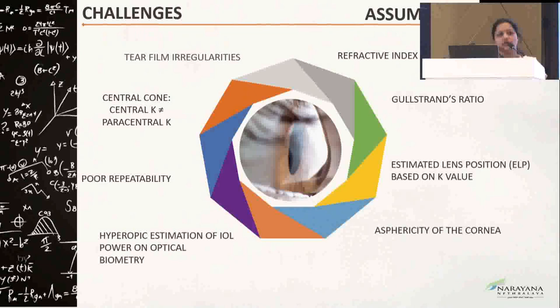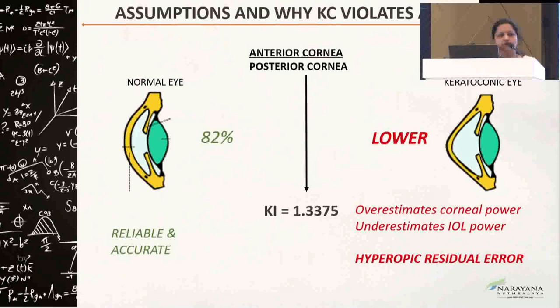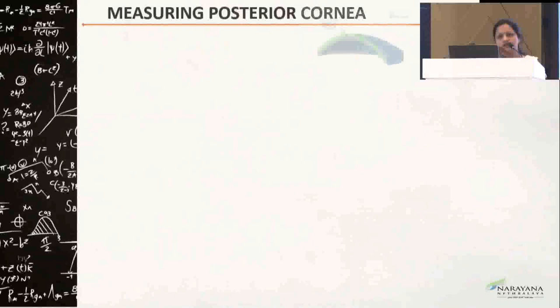Coming to assumptions, for normal IOL calculation, the assumed ratio between the anterior and the posterior corneal curvature, that's basically the Gullstrand ratio, which is supposed to be 82%, does not hold in keratoconus. Because of posterior thinning, this ratio is altered. One more thing is, the normal corneal refractive index is 1.376, but we use a keratometric index of 1.3375 for all our IOL calculations. And this keratometric index will also be altered because of posterior corneal thinning, which leads us to the second most important thing, measuring the posterior cornea.